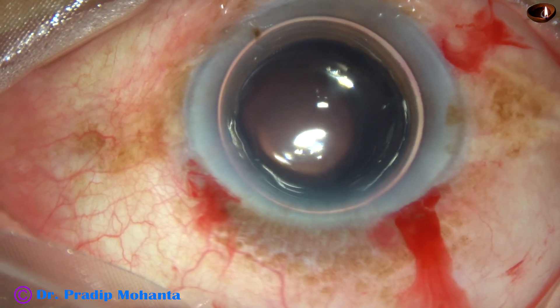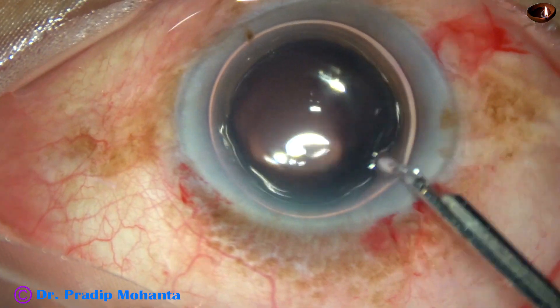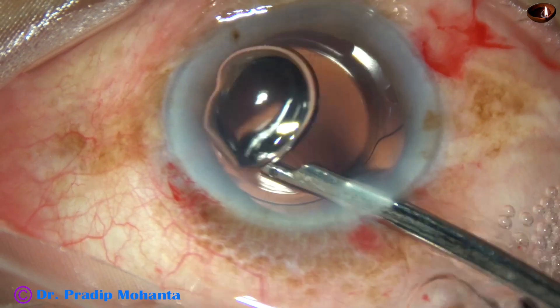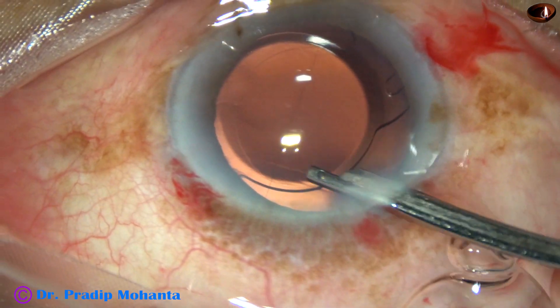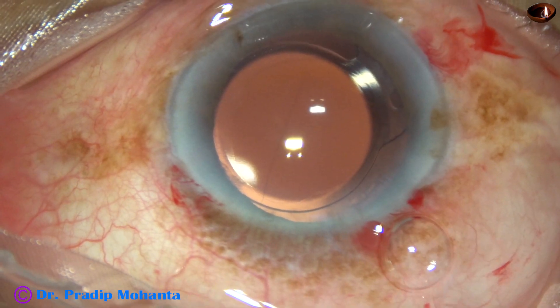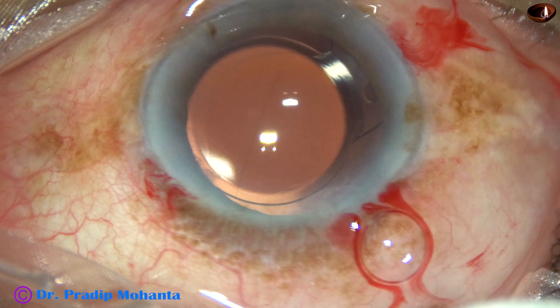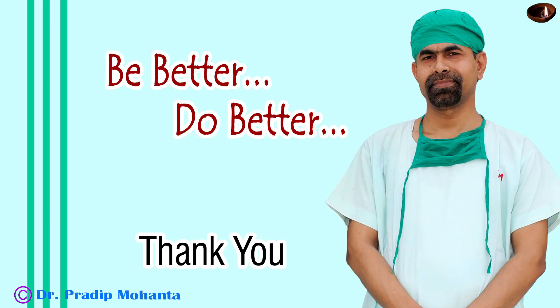The anterior chamber became very shallow, and this is the final reformation of the anterior chamber. The anterior chamber is formed in this way. Then the integrity of the wounds is checked — there should not be any leakage from any side. And then the case is concluded.